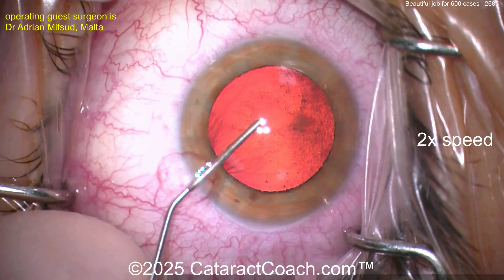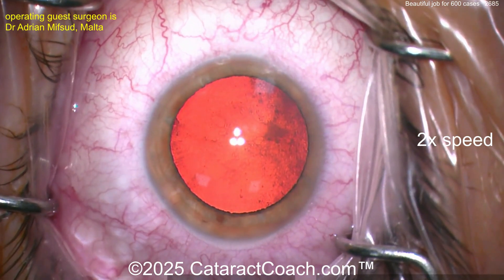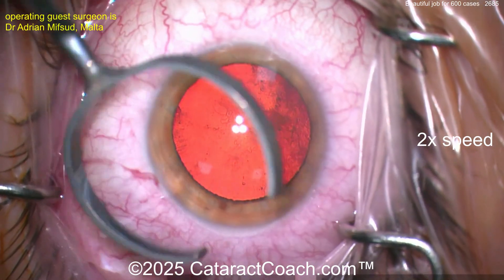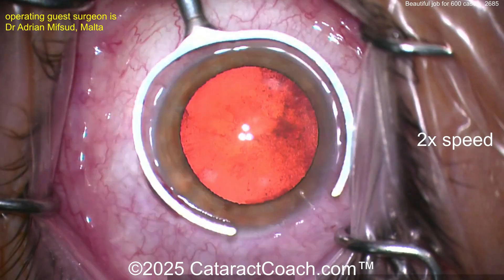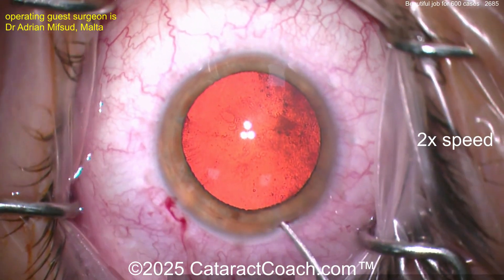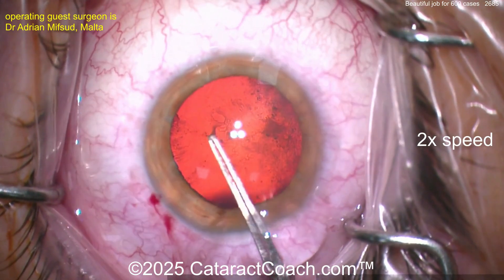Now coming up with our viscoelastic. Looks like maybe a cohesive agent by the way it's coming out. Let's watch the main incision now. Fixation ring going down again, here comes the main incision, hitting those limbal vessels. Tunnel length looks pretty good — single plane incision. I like it. That little bit of bleeding from the limbal vessels — I love that. It just means the incision heals so beautifully with time.